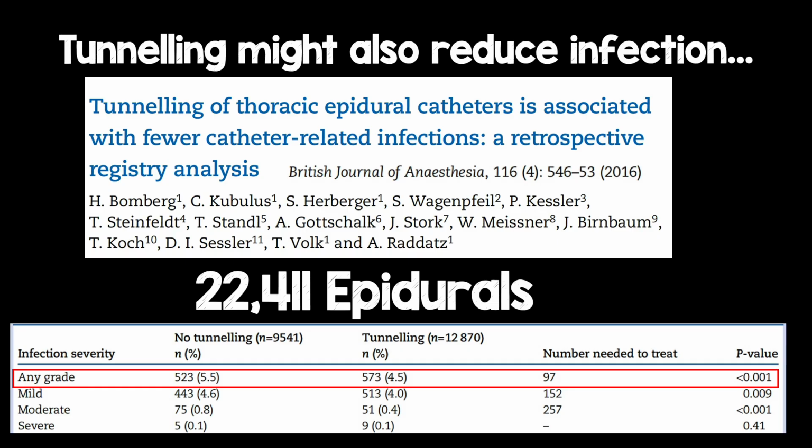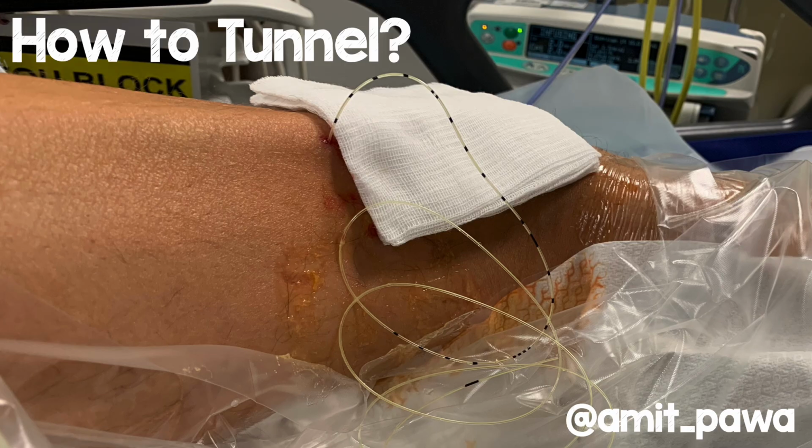But it's also possible that tunneling might reduce the risk of infection. And this was an example of tunneling with thoracic epidural catheters. I know many people are tunneling the catheters if they want them to stay in for a significant amount of time. And you can see how low the risk of infection is.